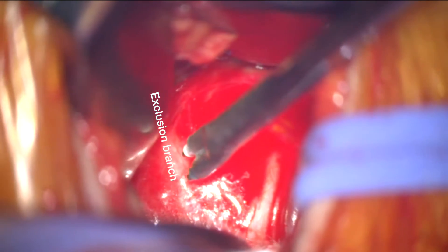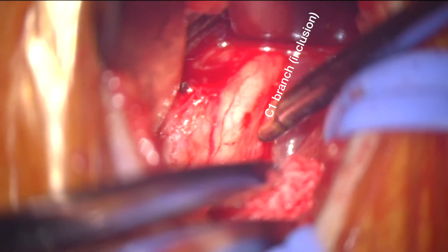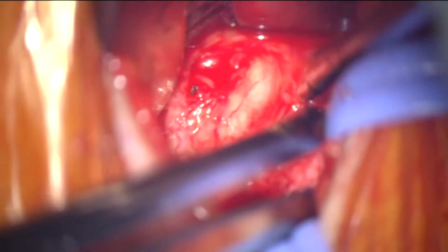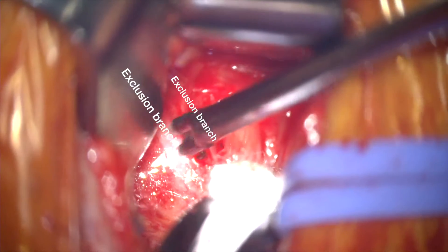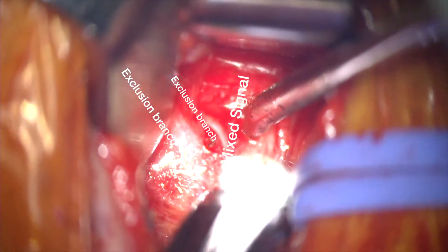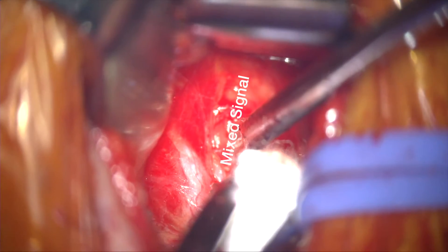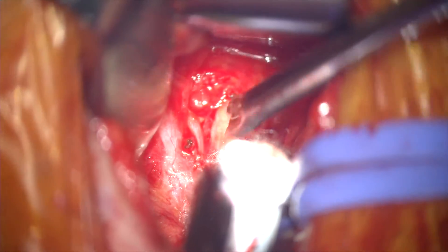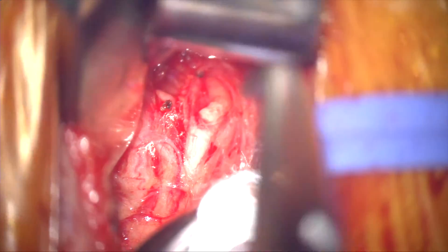We're dissecting a tunnel. You can see the exclusion branches and the inclusion branches there. We're also identifying a small branch to the geniohyoid muscle, which we like to include in the stimulation cuff. For this patient we're starting to see some signals on the back side of our genioglossus nerve bundle that we want to separate out. That branch occurs in approximately 20 to 25 percent of patients, and it's very key that we identify and dissect that free before placing our stimulation cuff.